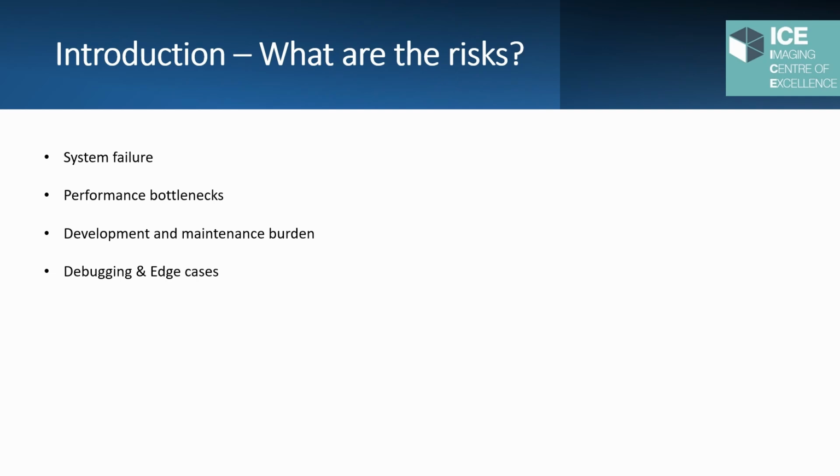Another feature of Docker is that the images will always work the same way whether they are deployed today or years from now, here at ICE or on a machine in another part of the world. Over time, the number of functions will grow, either by myself or by users making requests, so development of these tools will grow organically to accommodate the research that is being done in the community.